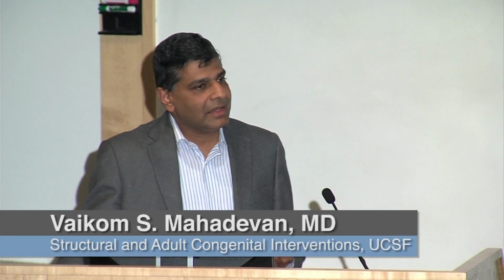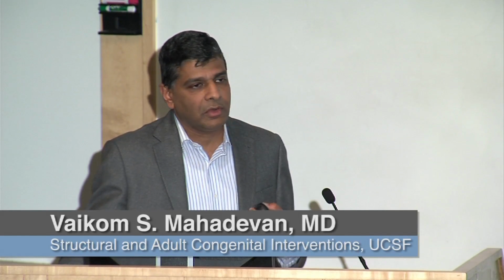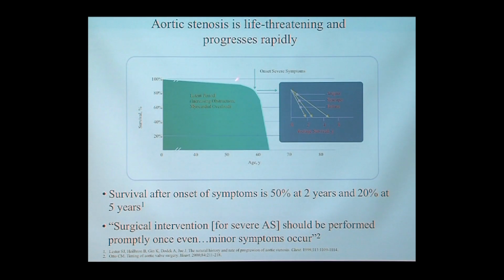So I will go to the transcatheter aortic valve, which is kind of all the rage now, in the sense that a lot of elderly patients who are unsuitable for surgical aortic valve replacement can now be considered for this therapy. As I said, the first procedure was done in 2002. And aortic stenosis is actually a pretty bad condition. This is the narrowing of the aortic valve. Sadly, this is a condition of aging because of degeneration, of calcification, calcium forming in the valve.